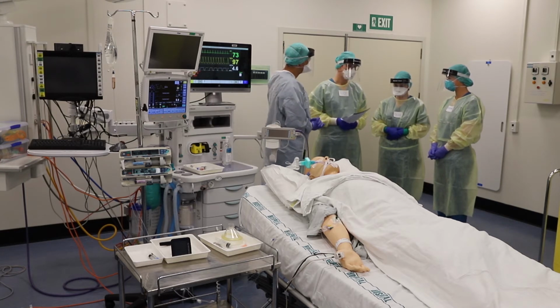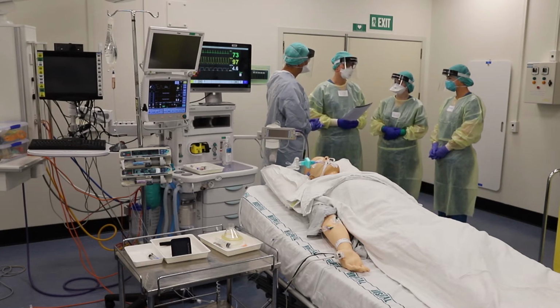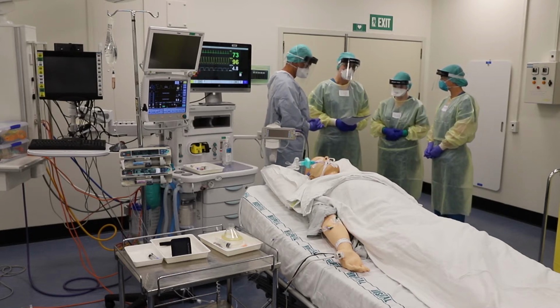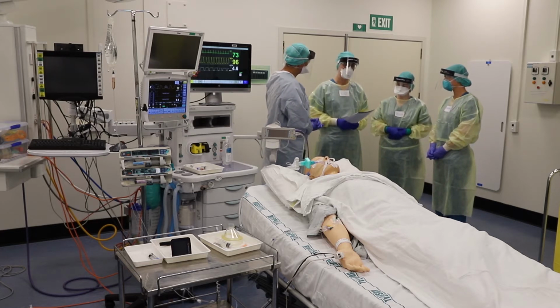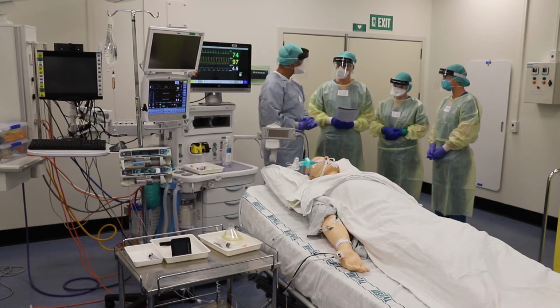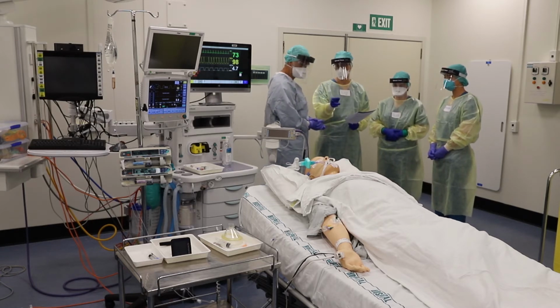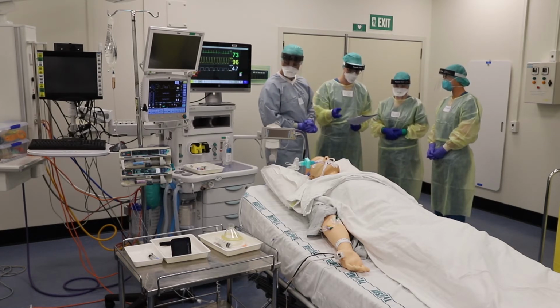If he happens to get agitated, then we have propofol drawn up, and we can give 1 or 2 mils of that. I'm also happy to step in if anything. Thanks, Olivia, that's great. And there's always a chance that we'll need re-intubation. So propofol and suxamethonium are drawn up. And Chris, we've got the emergency boxes in the room. Okay, so that's on the trolley. We've got the lidocaine and we've got sugammadex for reversal, and we have the emergency drugs there on the machine.